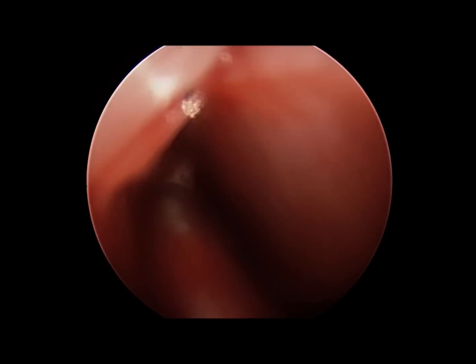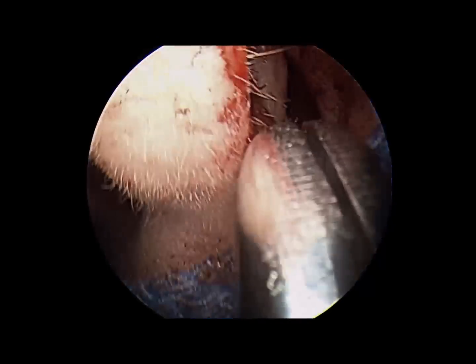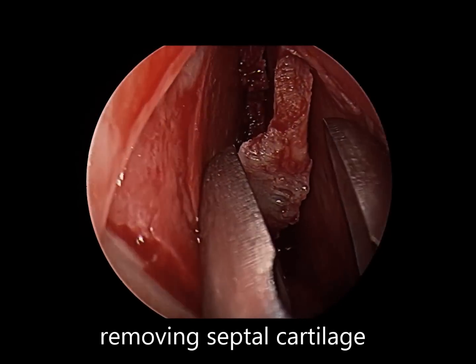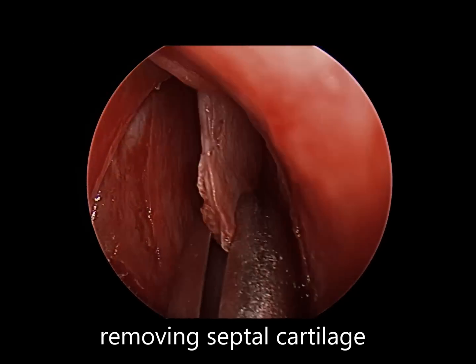The cartilage had been cut only halfway through, and the caudal elevator was used to complete that cut, as well as to separate the cartilage away from the bone beyond and the floor, and we then can remove the anterior aspect of cartilage to better expose the bone beyond.